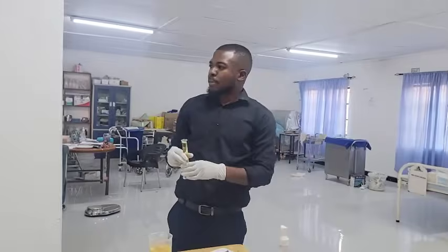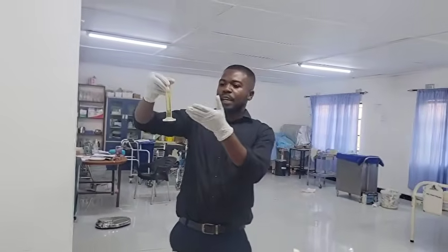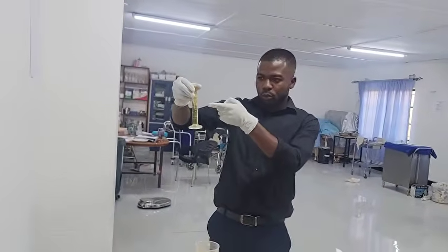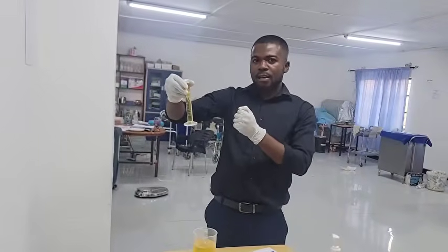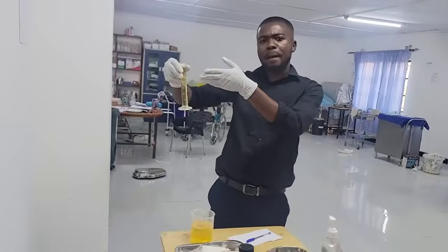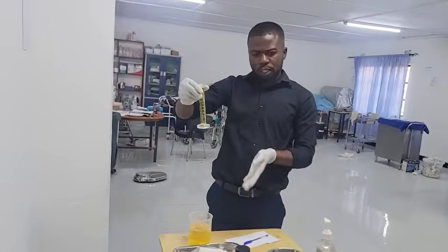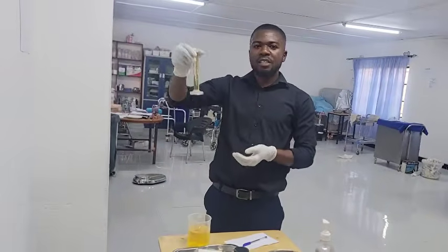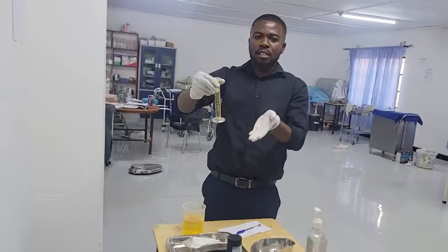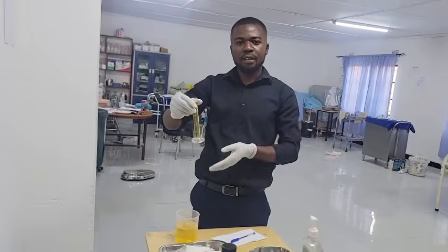The last things you are going to look at: is the urine containing blood? Is it blood stained? You need to check. Apart from that, you also check, is there pus? Is the urine looking cloudy? If it's cloudy, you tell the examiner, my examiner, the urine is cloudy, or the urine is containing blood, blood stained. If there is pus, say, my examiner, the urine is containing pus.